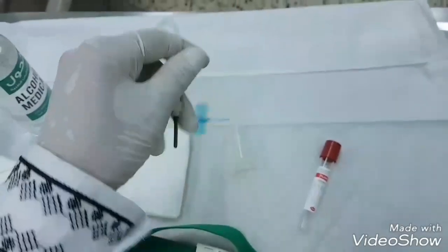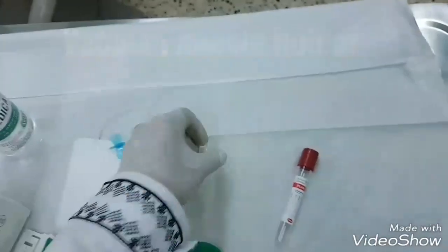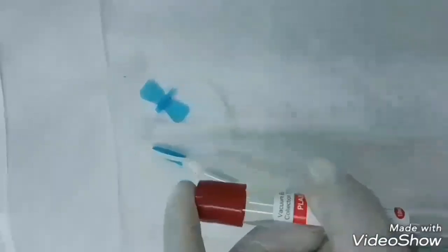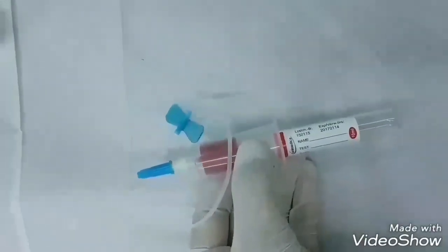This is the vacuumed butterfly needle; the other end will be inserted in the holder. This is the holder, or vacuumed needle holder. One end of the butterfly needle will be inserted in the patient's arm vein, and the other end is inserted in the holder. After that, insert the tube into the holder in this way, and collect the blood in it. You should remember not to insert the glass tube in the holder until the blood has been drawn through the butterfly needle.